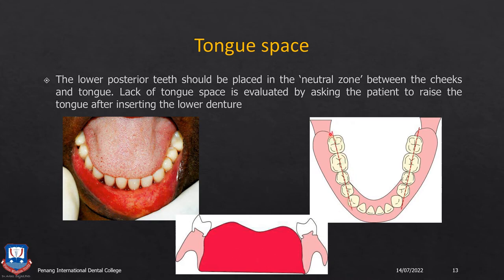As I mentioned in the previous lecture, this is called the pound line. That is a line extending from the lingual border of the retromolar pad to the mesial line angle of the canine. On this line, the denture teeth should not encroach, but they should be arranged on the crest of the ridge.